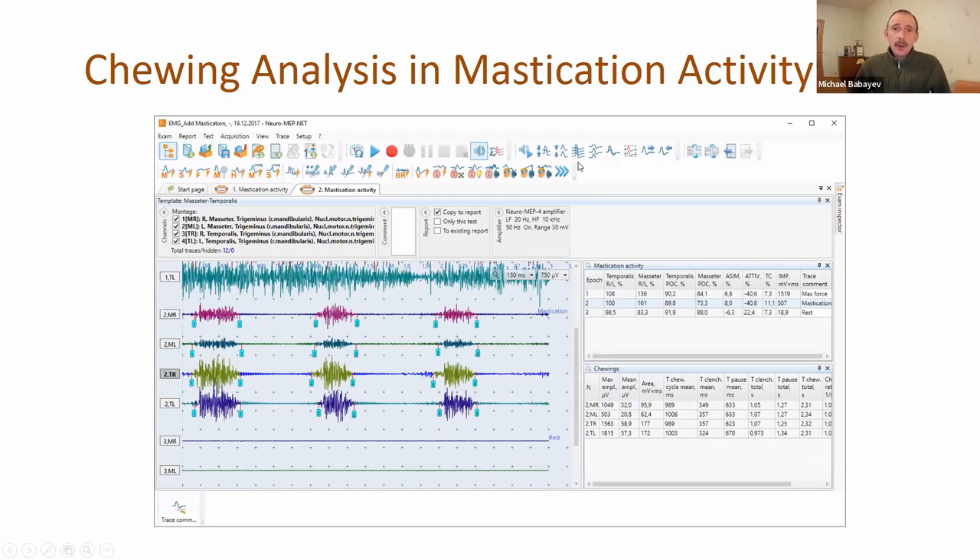We had a special mastication activity test in the program some time ago, and now we made some changes. We added chewing analysis. Now it's possible to place markers at the start and end of the clench. We added a new table with maximum and mean amplitude, chewing cycle, pole cycle, and so on - a lot of different information.